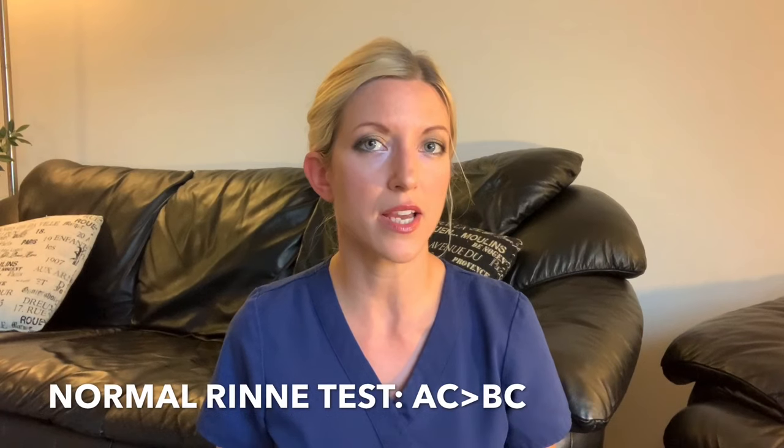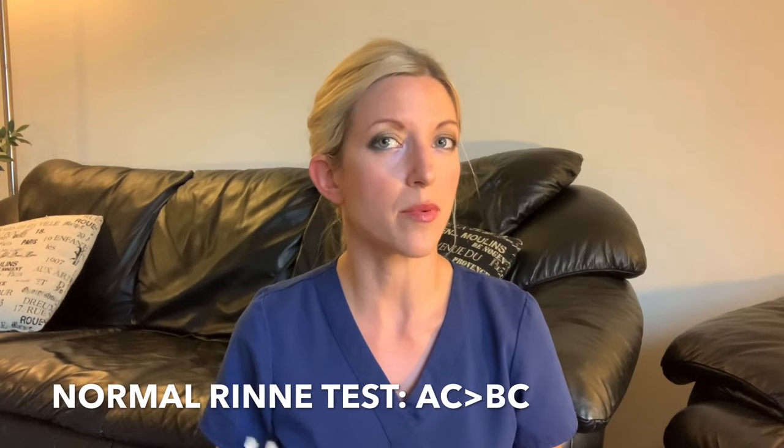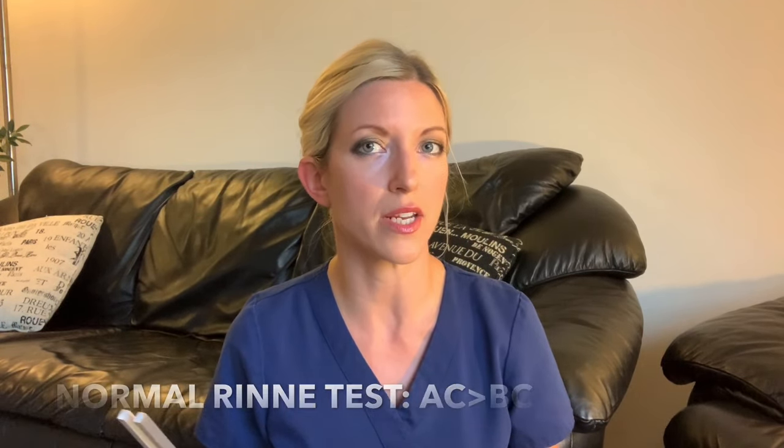To perform the Rinne test, you're going to activate your tuning fork. Be careful not to touch the prongs — once the tuning fork is activated, hold it by the stem. You're going to place it on the mastoid bone and ask the patient when they can no longer hear the sound. At that point, move the tuning fork and hold it about one to two centimeters from the outer ear, and ask them again when they can no longer hear the sound. In a normal Rinne test, also called a positive Rinne test, air conduction is approximately twice as long as bone conduction.